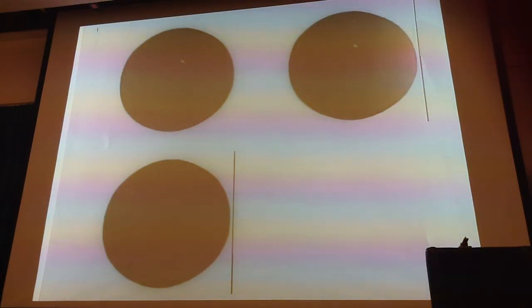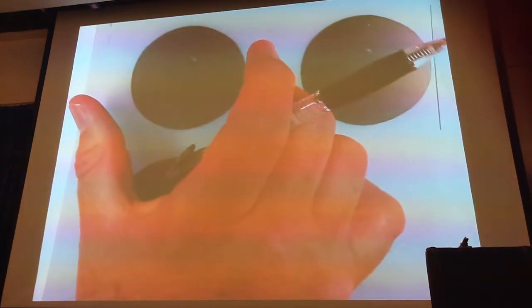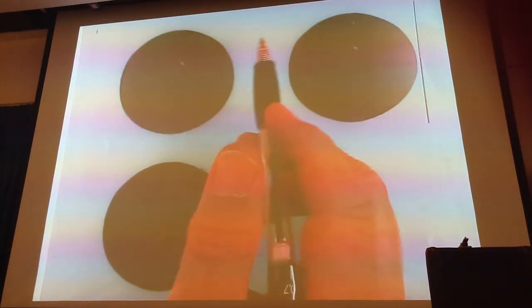Is that where somebody bumped the crystal? You're getting closer. Somebody damaged the collimator. Remember we said they used to have lead septa? Normally, to make sure that it is the collimator that's damaged, if you can, you rotate this thing 90 degrees. And if this thing moves when you rotate it, then that means that it's the collimator. Okay, does that make sense?